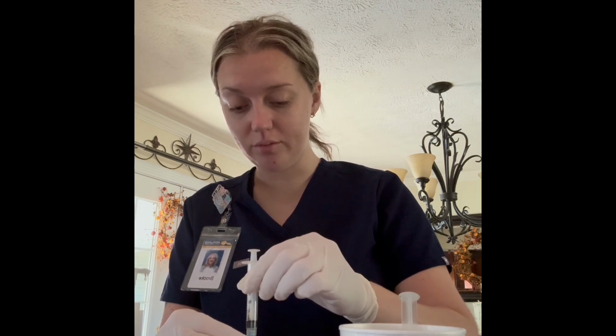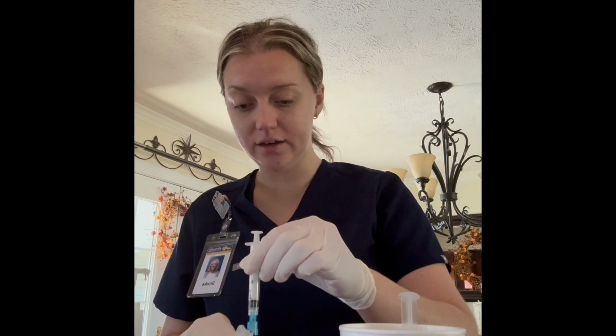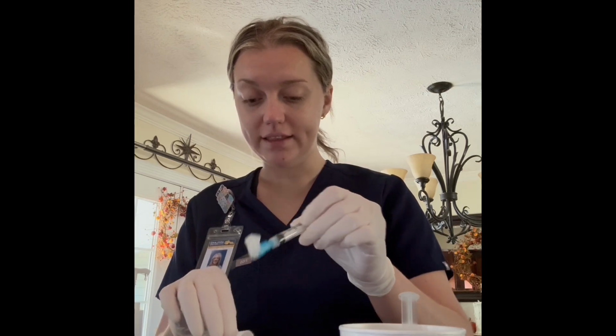And then I'm going to remove my non-dominant hand and pull out the needle at the same angle it was inserted, and then engage my safety device and apply pressure to the site. And then I would bandage this and then repeat the steps that I will show later.